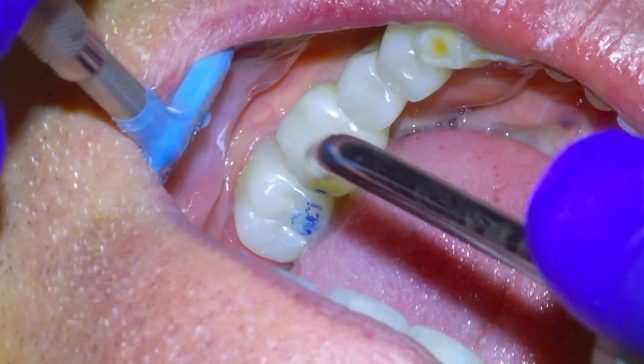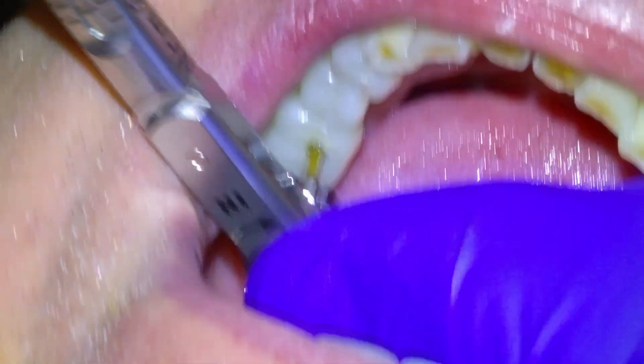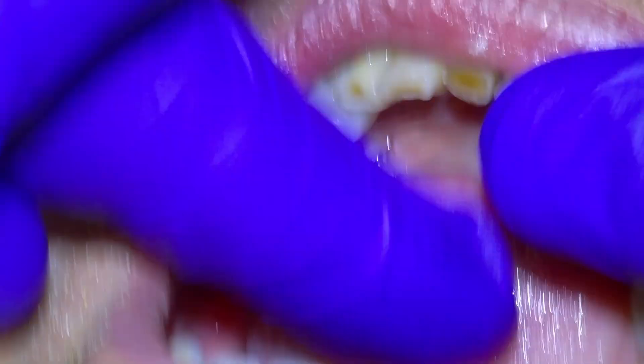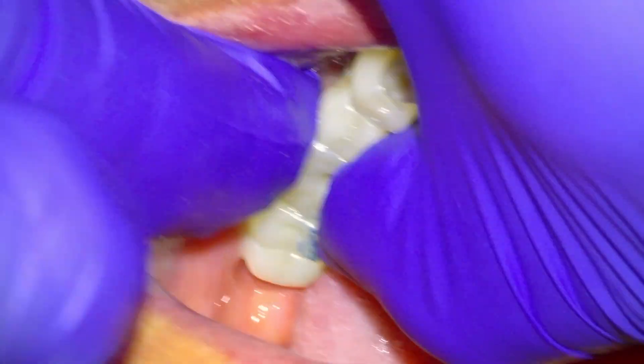How does that feel there? Still a little ways to go, right in there. It doesn't feel too bad. Okay, so we will close that up. That's good. And then we do need to re-torque it, which we can probably do in Creston. Can't do it there.